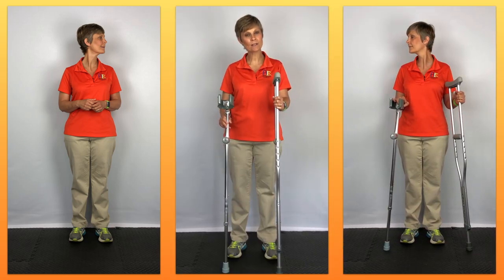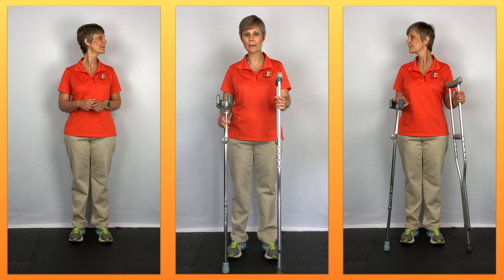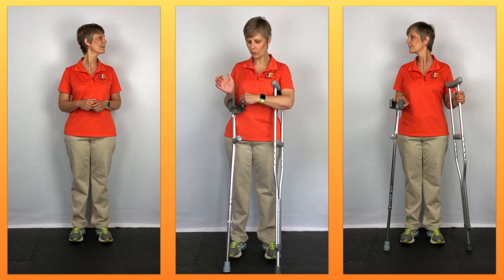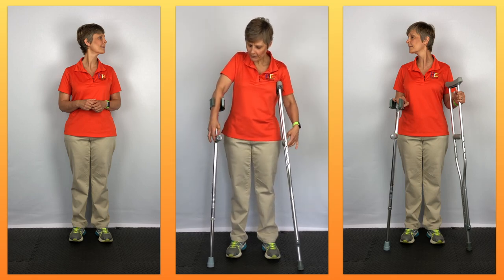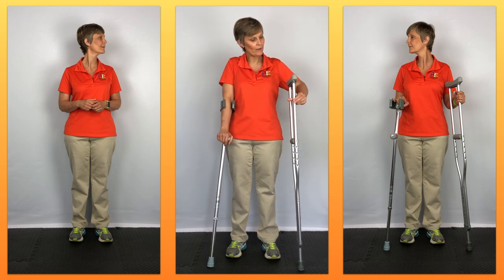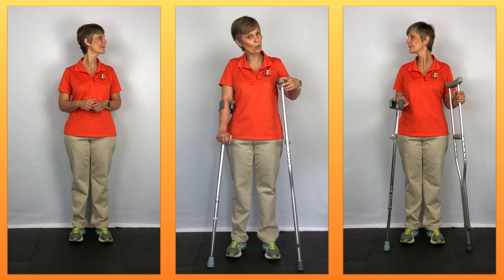The last point is comfort, which has a lot to do with weight bearing. With both crutches, you are bearing weight right down through the palms of your hands, so you'll often see people build up the hand grips for more padding. On the axillary crutch, that applies if you're not leaning on it in the armpit area, which of course we don't recommend.